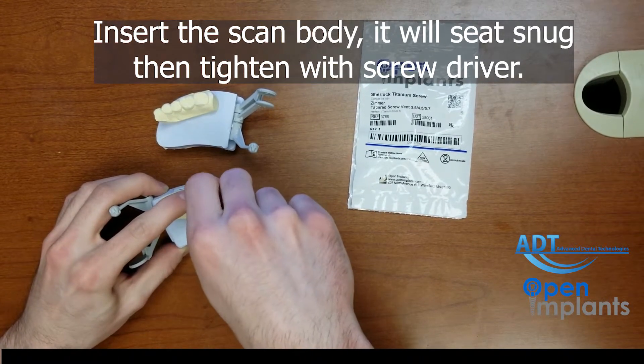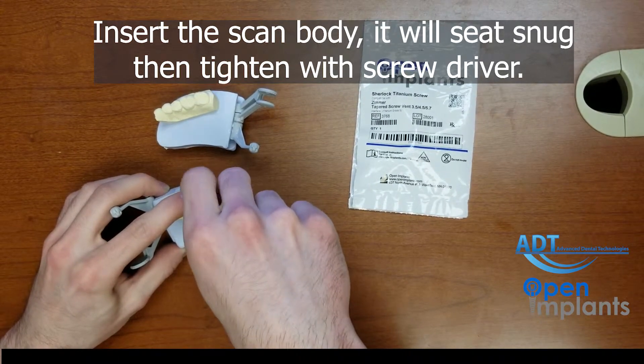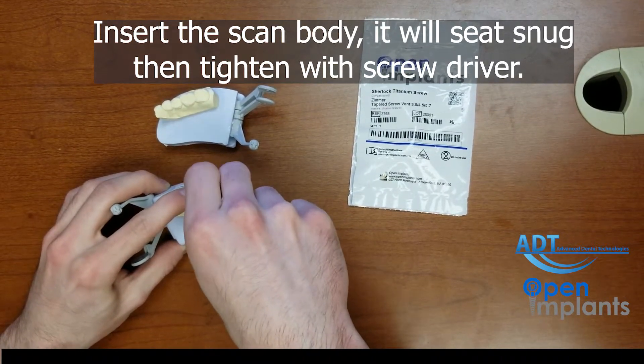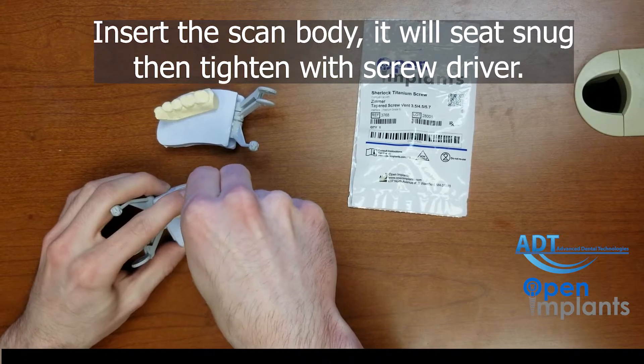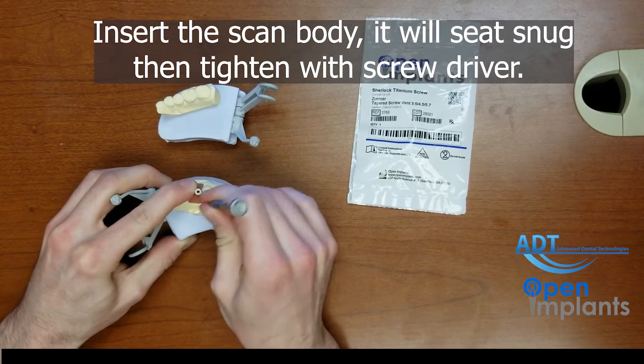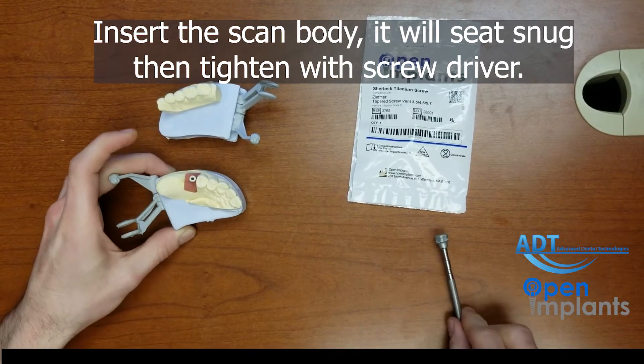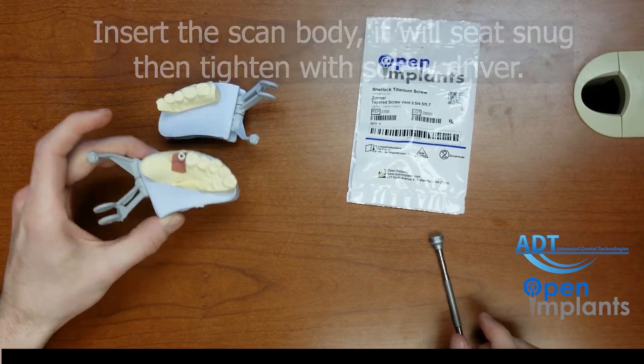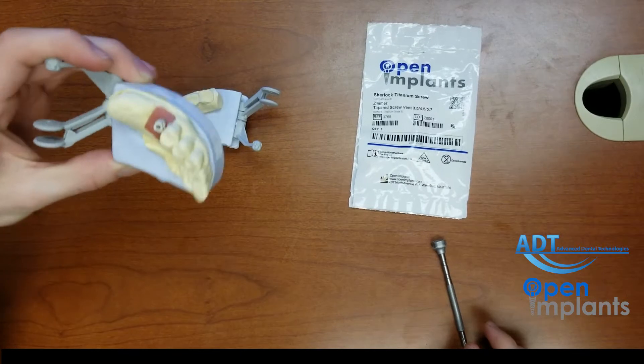One note on these screws is that they are integrated and will not fall out. It is compatible with the manufacturer driver. Now we are ready for the first scan.